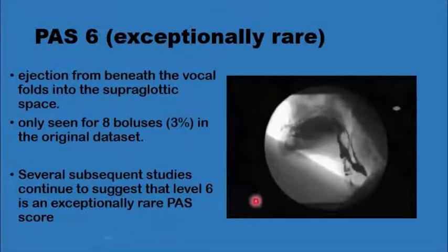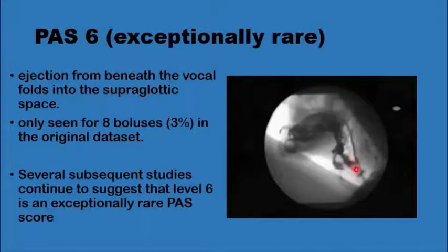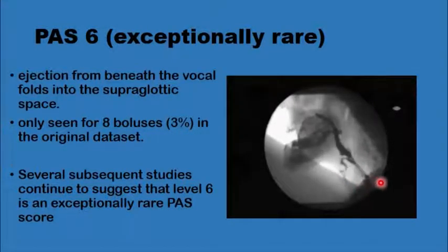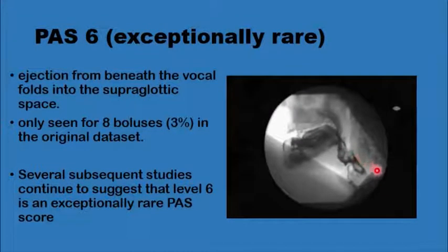You would see how the aspirate material dips deeper now into the subglottic space, but it's promptly cleared by the coughing into the supraglottic space and ultimately swallowed by the patient. This is actually a very rare level. It's seen in only about 3% of the video clips.